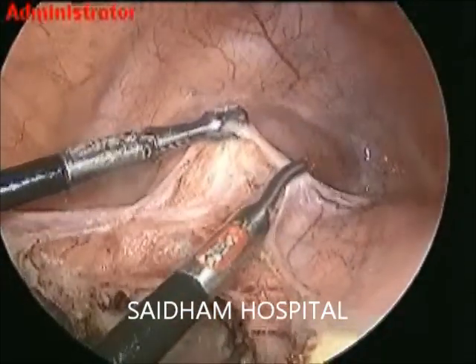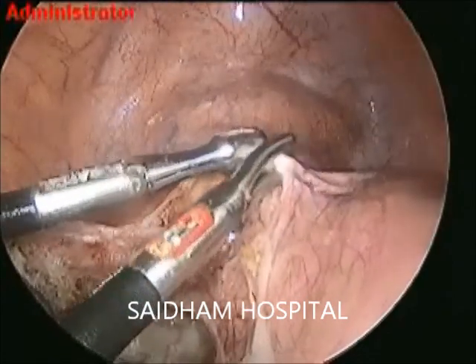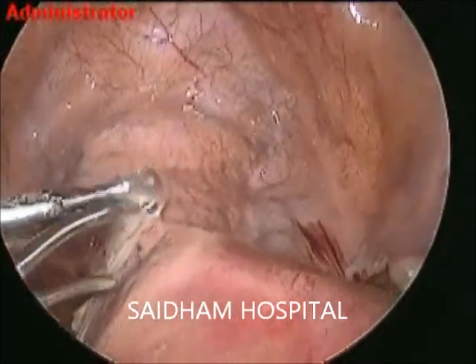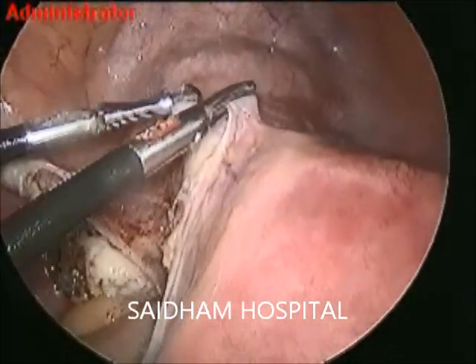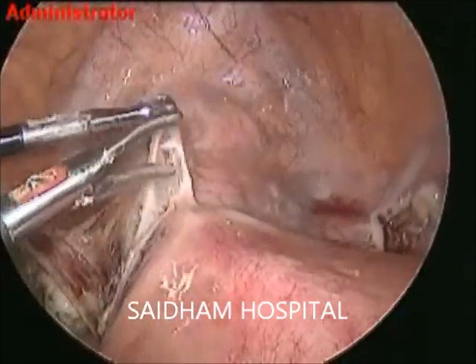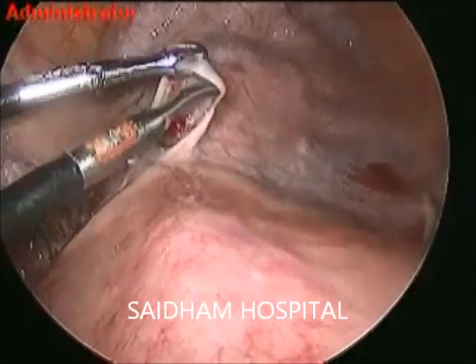Our center provides endoscopic training to budding gynecologists. We have trained more than 100 candidates — you can join any time in the training academy. The tissue here is very tough and plain separation is very difficult. Lift and cut — we will go till the right round ligament at its mid. This is a combination of adenomyosis and endometriosis.